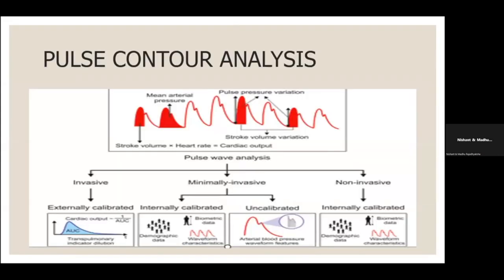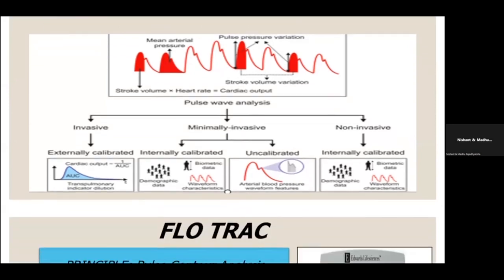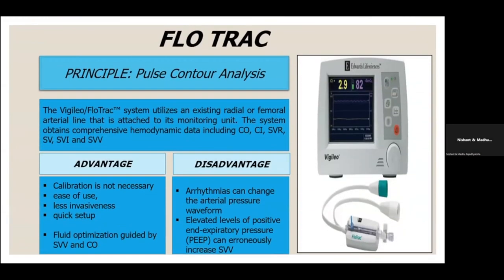Pulse contour analysis is a technique of measuring and monitoring stroke volume on a beat-to-beat basis from the arterial pressure waveform. Pulse contour analysis is an integral component in measurement of cardiac output. FloTrac works on the principle of pulse contour analysis.